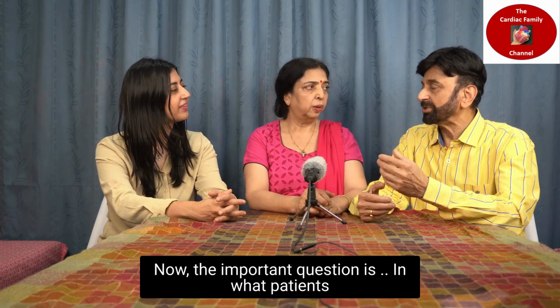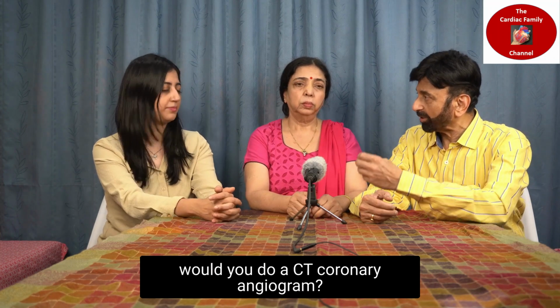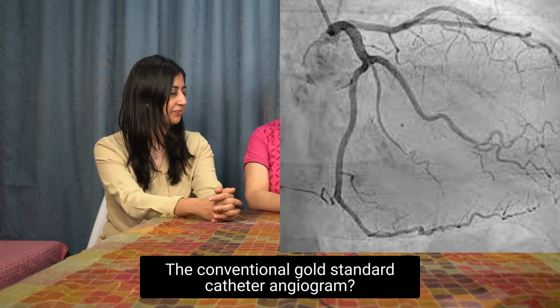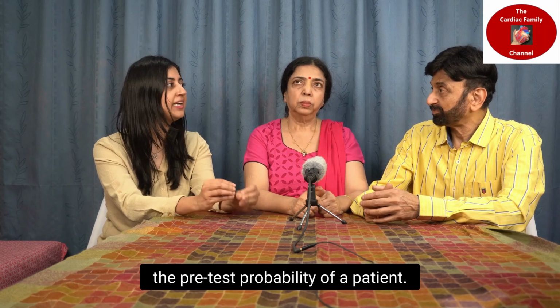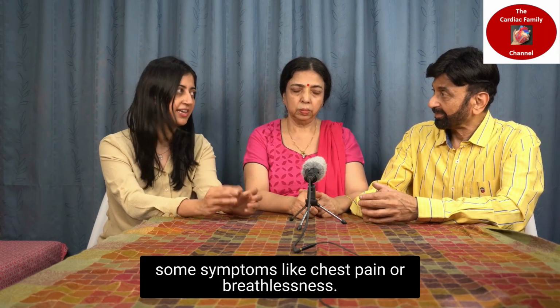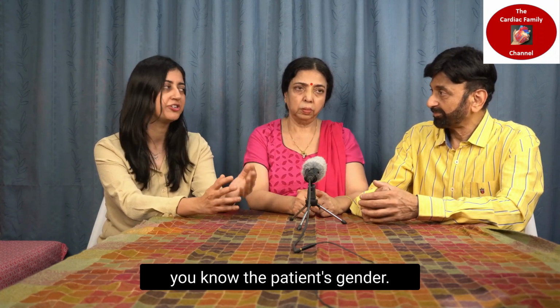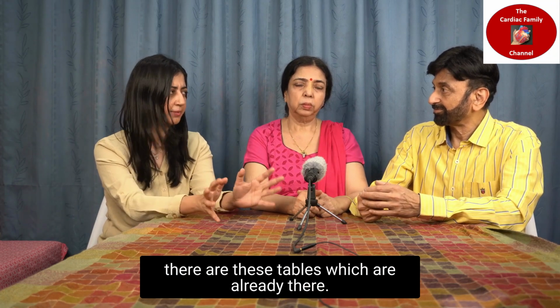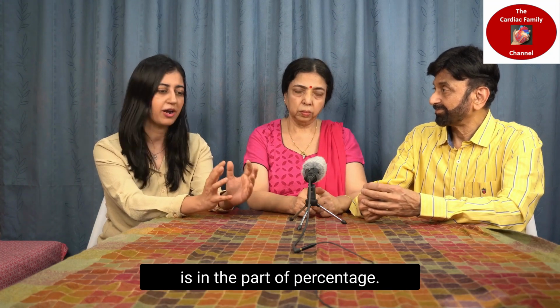Now the important question is, in what patients would you do a CT coronary angiogram, or in what patients would you subject them to the conventional gold standard catheter angiography? Well, it all begins with computing the pre-test probability of a patient. So in short, you have a patient with some symptoms like chest pain or breathlessness. Then you know the patient's age, you know the patient's gender. Based on these parameters, there are tables which are already there to understand the pre-test probability. It is in the form of percentage.